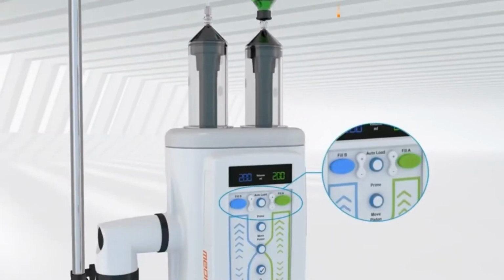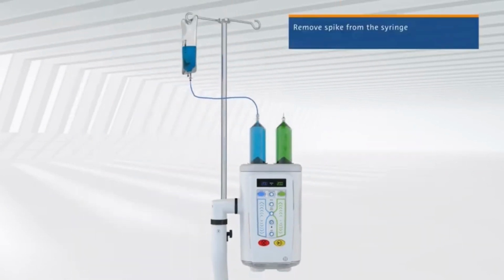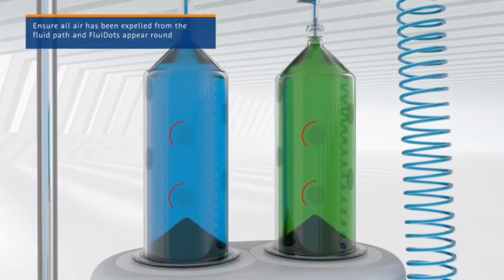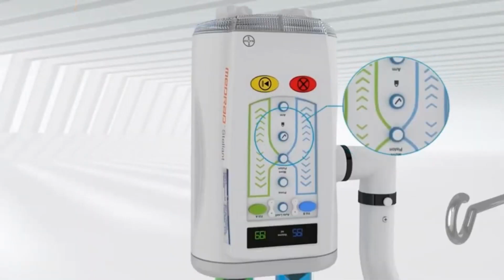Automated contrast injection systems help physicians monitor the dosage used. Some systems also allow physicians to set the precise amount of contrast used during each injection. Manual devices and some automated systems do not allow for meticulous control of the flow rate, amount, and peak pressure.